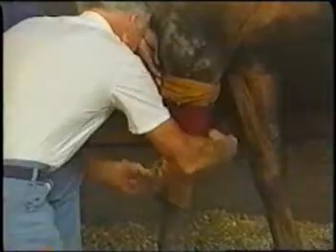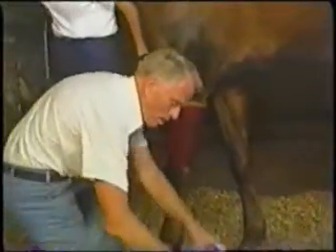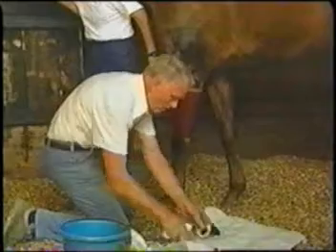Now you put a bandage over the chamois quite tightly so as to prevent the chamois from slipping down. Only a chamois like this will give you the necessary traction. If you don't use the chamois, the muscle stimulator will slip down the leg and you lose it.